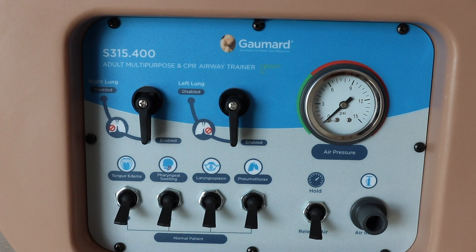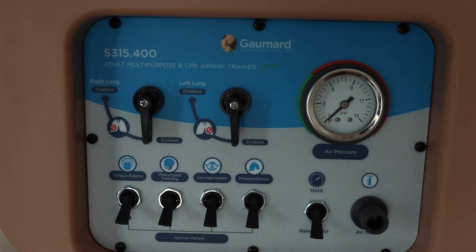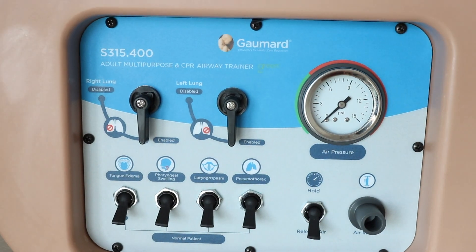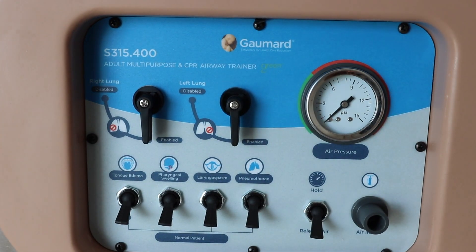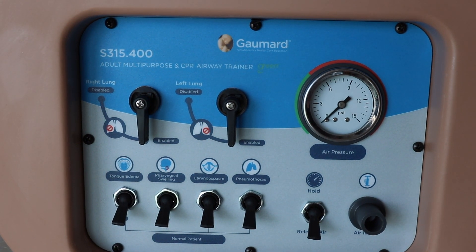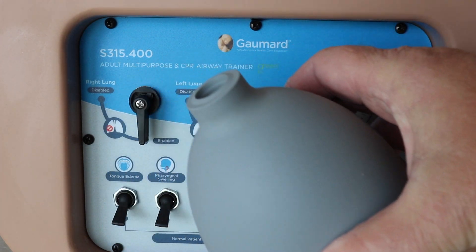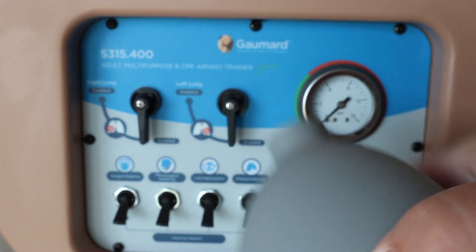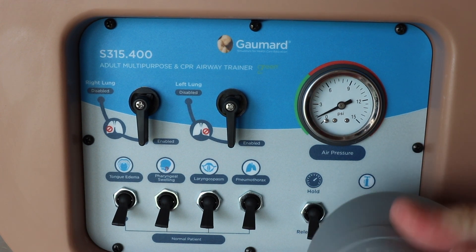We'll go over some of the switches and knobs at the base of the mannequin — they're pretty self-explanatory. You turn something on and it's going to either activate or deactivate something. You're going to have to pressurize the system first, and you'll see the pressure gauge — it's really important because we want to make sure we stay within the recommended pressure.